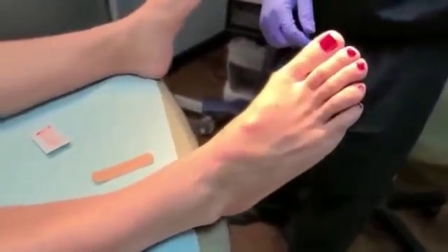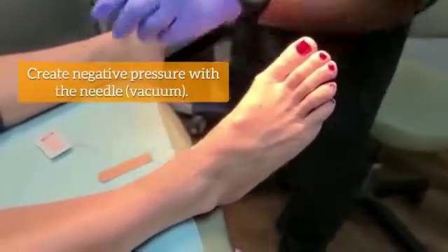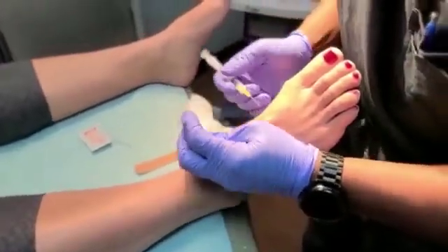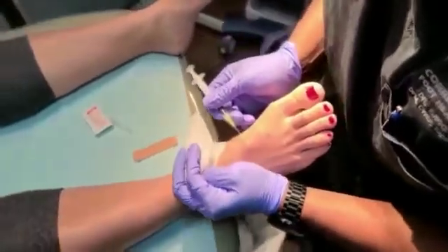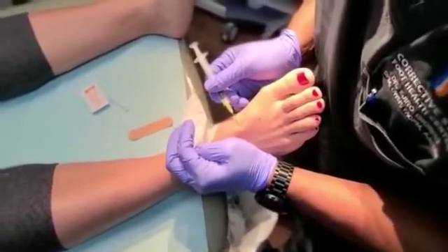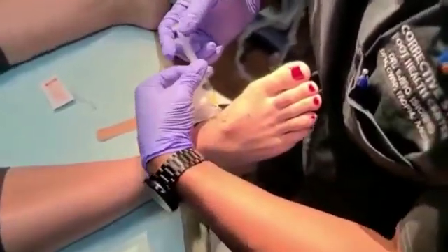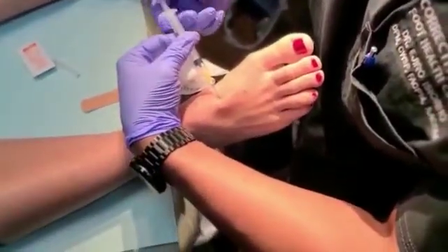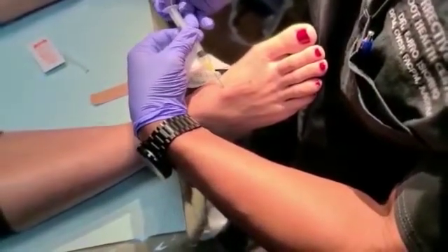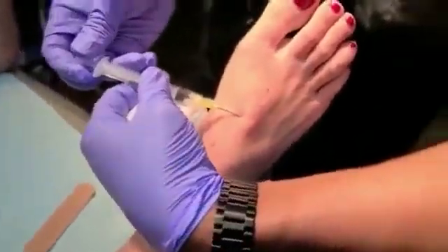I have a couple of different needles — so if you are squeamish, please look away. What I'm going to do is create negative pressure with my needle and basically try to withdraw some of this fluid. So once we have sterilized the area, I'll put the needle right into the cyst. You can see it pucker up a little bit because I'm actually creating a vacuum. And then we are going to aspirate or draw it out. What we should start to see is potentially some straw-colored fluid, or something thick and viscous, or something that doesn't move too much.